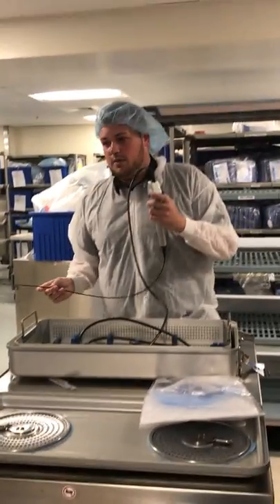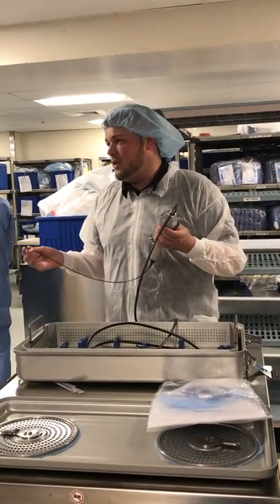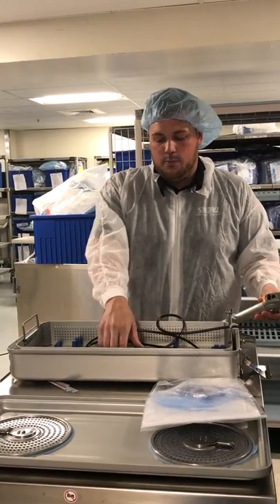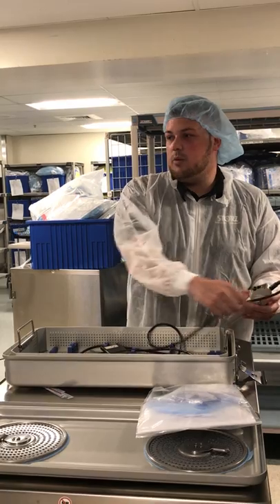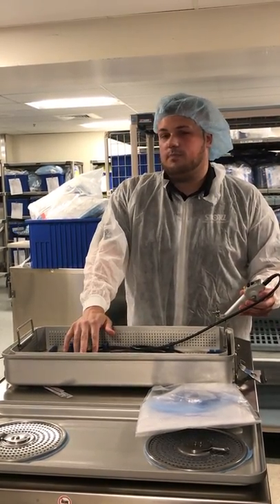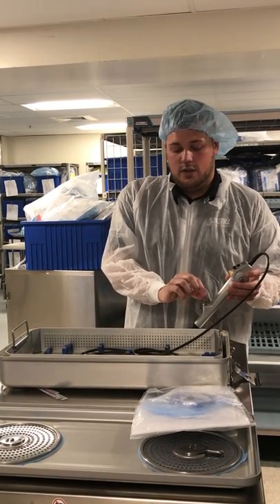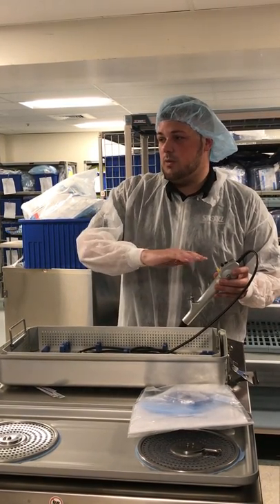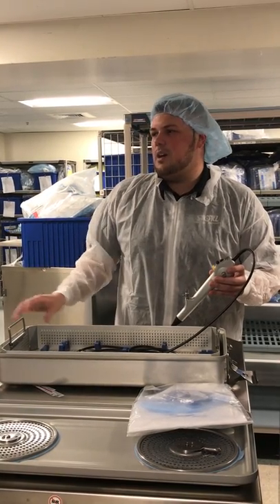Now for the step-by-step manual cleaning. Prepare your enzymatic cleaning solution, properly diluted per the manufacturer's recommendation, and fully submerge the scope. First, take a soft lint-free cloth or gauze and wipe down the cable. It's okay to get this chip wet — completely wipe it down. Next, hook it up to your automated pump and suction 100 ml of cleaning solution out of the working channel. We don't want to flush it back through — dispose of that contaminated solution in a separate sink or basin.